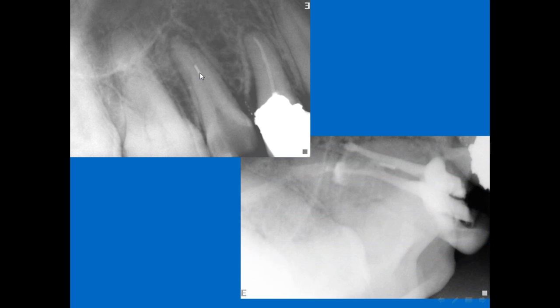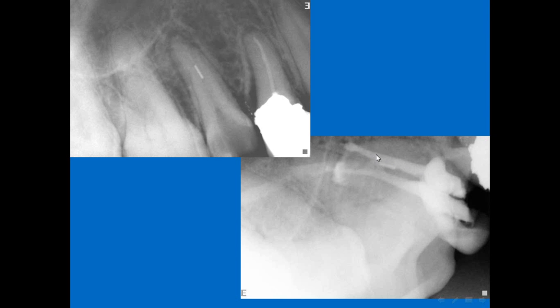Analyzing this separated instrument, it is evident that it is between the apical and the middle third region. Widening of the coronal third area allows more irrigation and lubrication. Negotiation with size 8 and 10 beside the fractured instrument allowed the bypass; then size 15 enters, after which rotary instrumentation starts and Thermafil obturation was used.